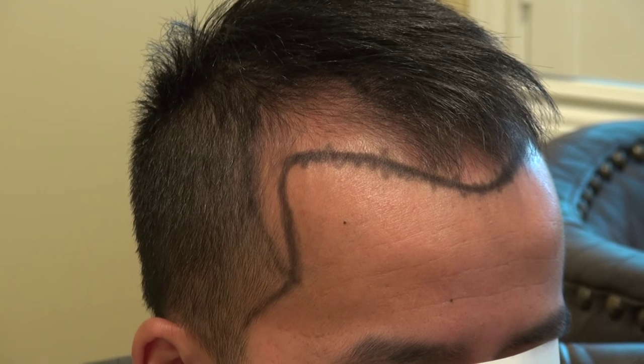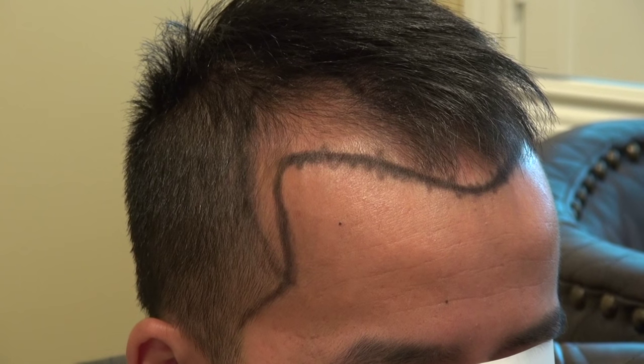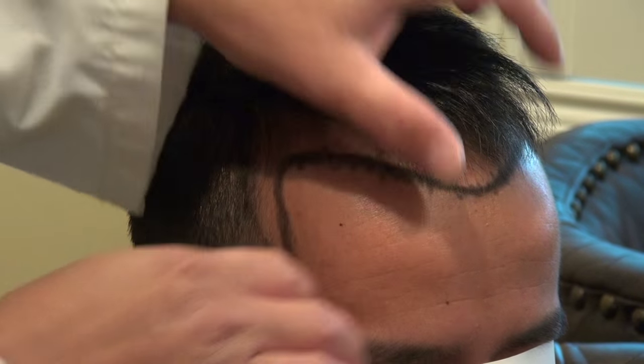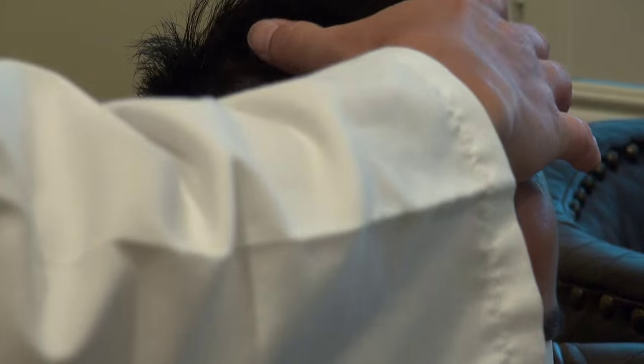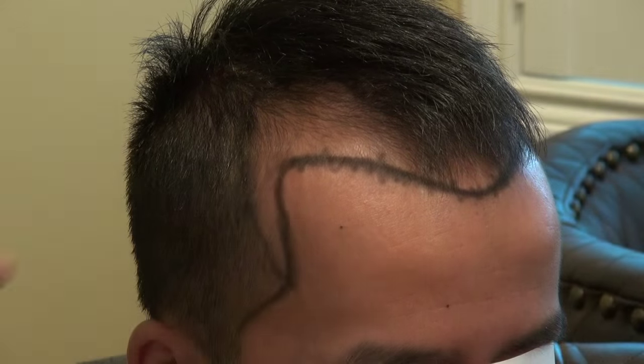This video is the art of hair transplant restoration surgery on a client with a class 3 hair loss pattern. He has a receding hairline, and not only is his hairline receding but his temple has gone back a little bit.